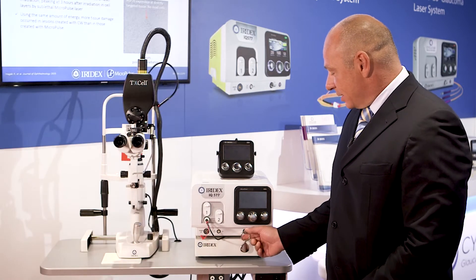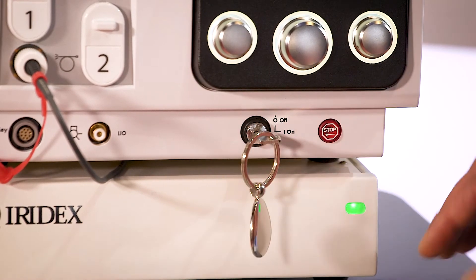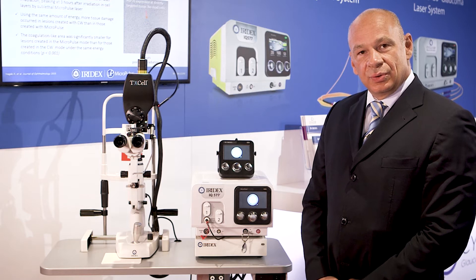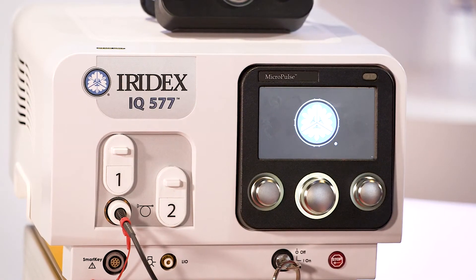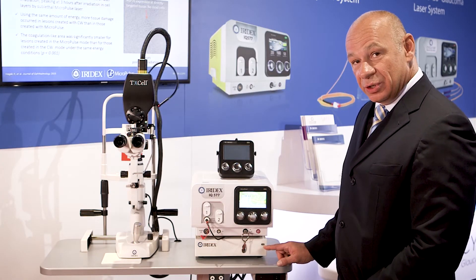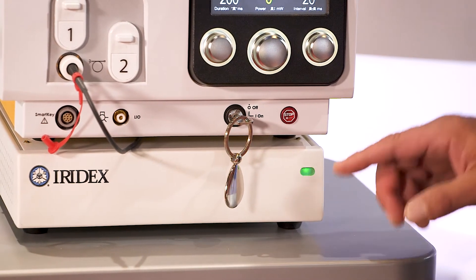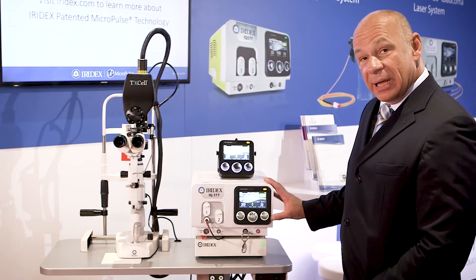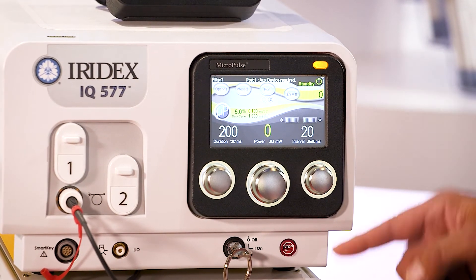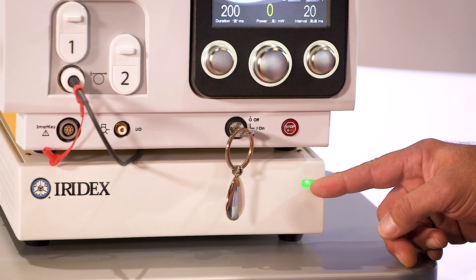In this case it's the IQ 577, so you turn the key clockwise. It is important that before you start to do any parameter settings or try to treat any patients, you wait until this green light — which you can see blinking here — is continuously on, regardless of whether the display of the IQ 577 shows a continuous light.